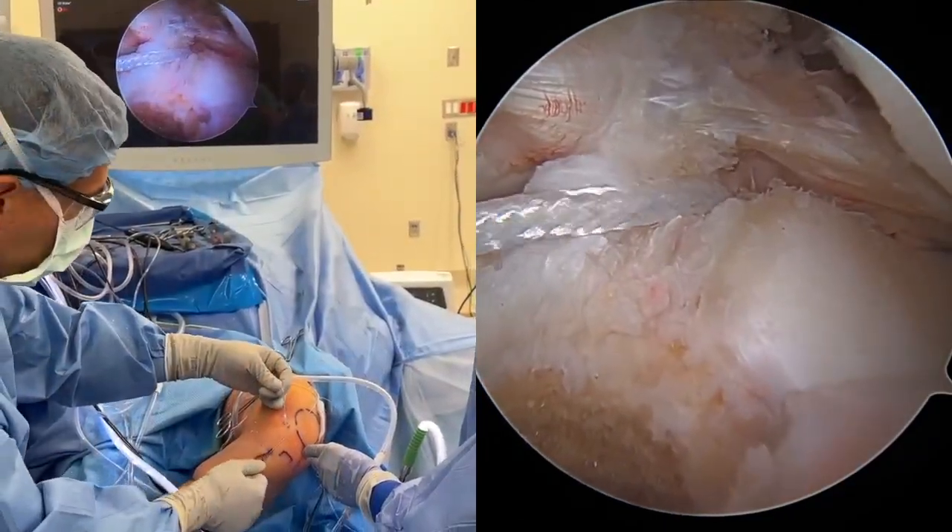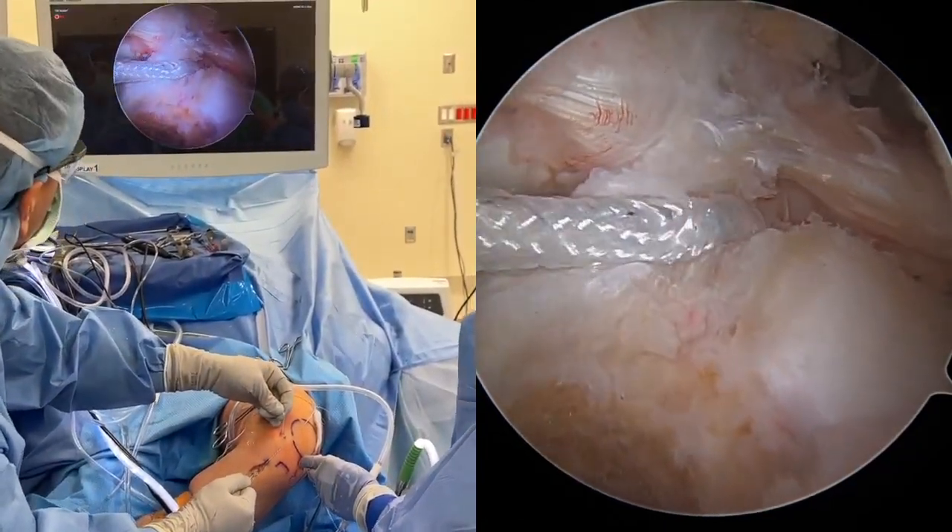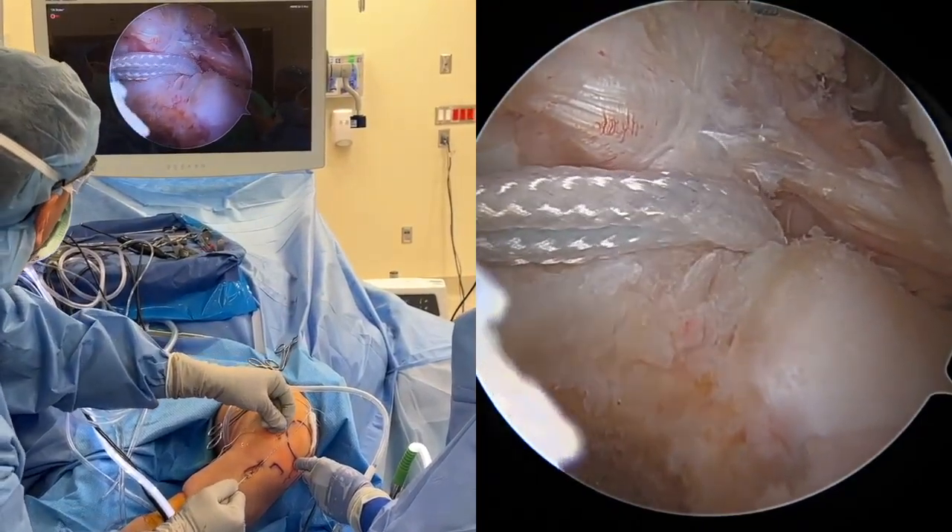The distal end of the suture lock implant at the anterior tibia is pulled until the suture lock loop is positioned deep to the tibial plateau.